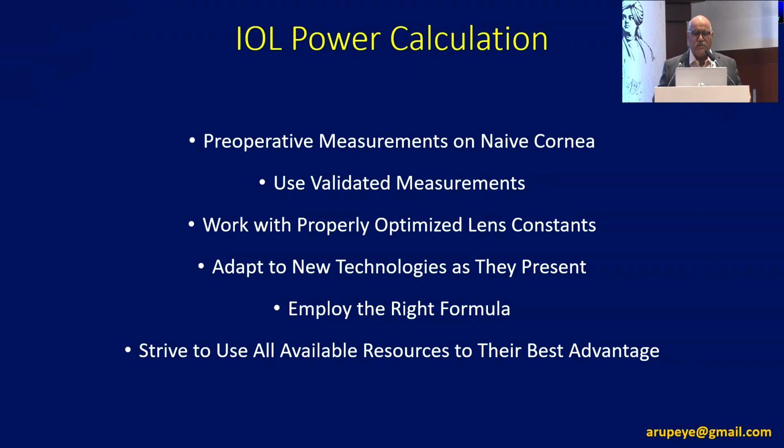So friends, the SOPs keep changing, and you need to always be abreast of the newer developments that are coming up. Use validated measurements, work with properly optimized lens constants, adapt to new technologies as they present, employ the right formula, and strive to use all available resources to their best advantage.